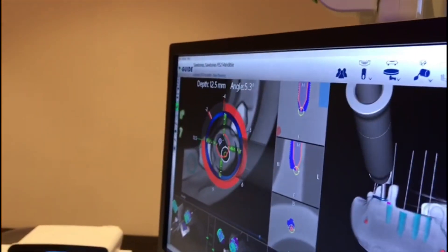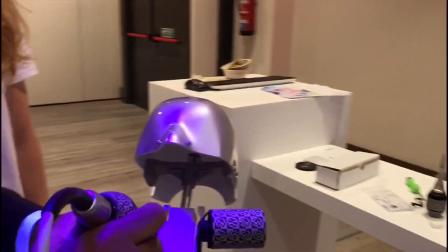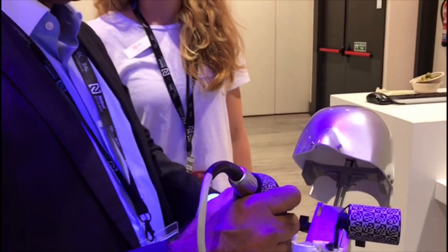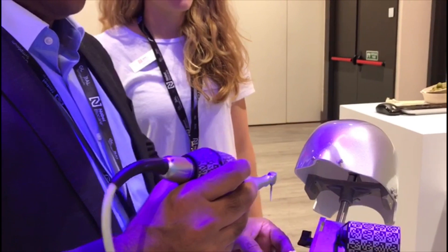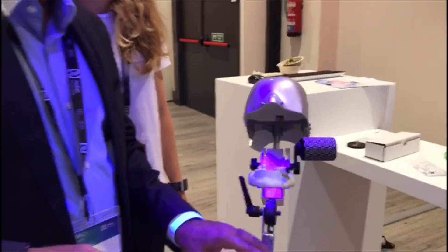The sound gives you an indication that you reached your planned depth. First time I went a little to the side, but the deviation is not much. Compared to freehand, you're still doing pretty good. Fantastic — it's a great system. Thank you very much.